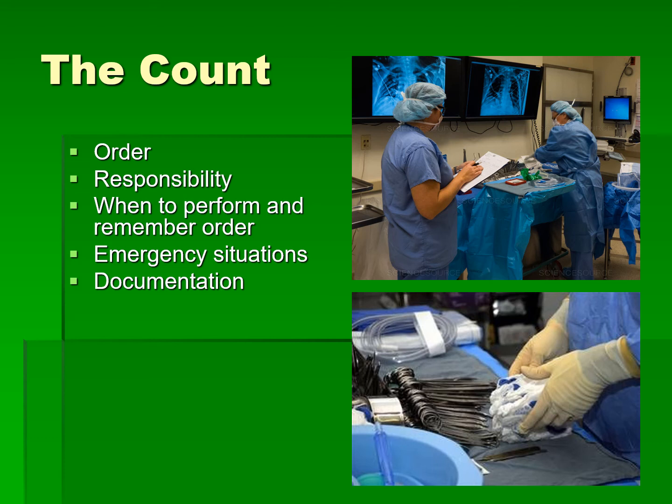Intraoperatively, any time any sponges or countable goods are added to the field, we need to stop and count those. So let's say intraoperatively we're working away and the surgeon's burning through Raytex sponges like they're going out of style, and we get another package of Raytex on our field. At that point, we need to stop and we need to count with the circulating nurse those new Raytex that were added to the field. Okay, so anytime a countable comes to the field, we need to count it.